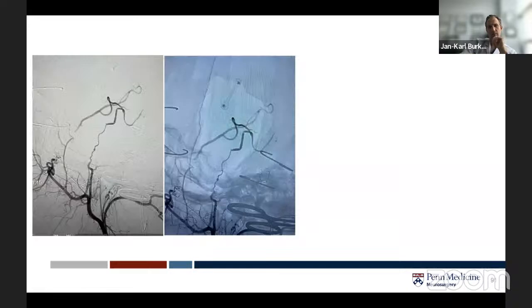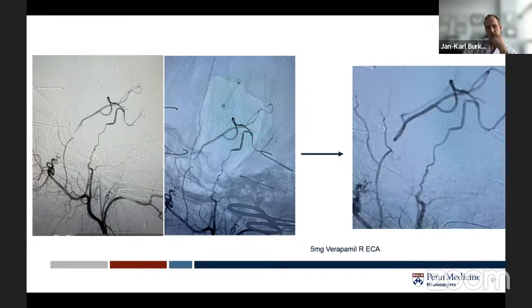But the intraoperative angiogram was interesting. The whole proximal portion of the STA was actually completely spasmed out, which was not indicated by the ICG because we saw the anastomosis was open. So in this case, I decided, with the diagnostic catheter being in the external carotid, to give some verapamil and improve that flow. It's a nice adjunct because I'm doing all my angiograms for bypasses as well to confirm, and if I see something there, you can intervene. So it's an additional help.